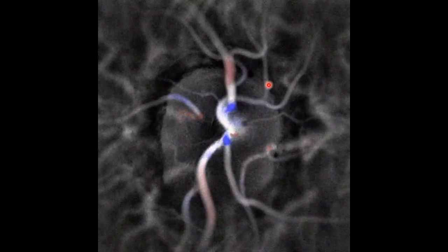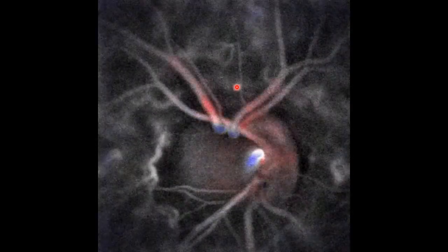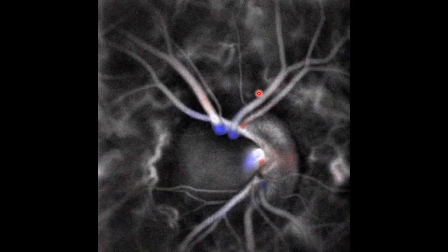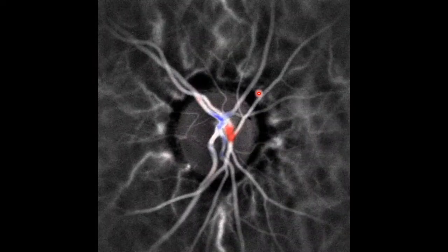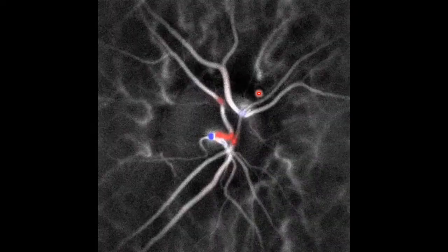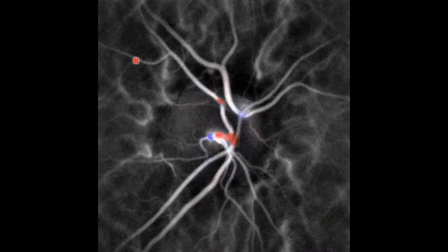A second interesting feature is that this contrast is very pronounced inside the optic nerve head, but outside in the choroidal vessels you cannot see any directional contrast. And we think that this is because of the multiple scattering of choroidal blood flow that occurs in the RPE that sort of ruins the spectral asymmetry on which the directional blood flow contrast relies, because this directional contrast relies on the direct backscattering that preserves the sign of the Doppler frequency shift. And it's no longer the case when there is multiple scattering in the choroid that will ruin the Doppler asymmetry.